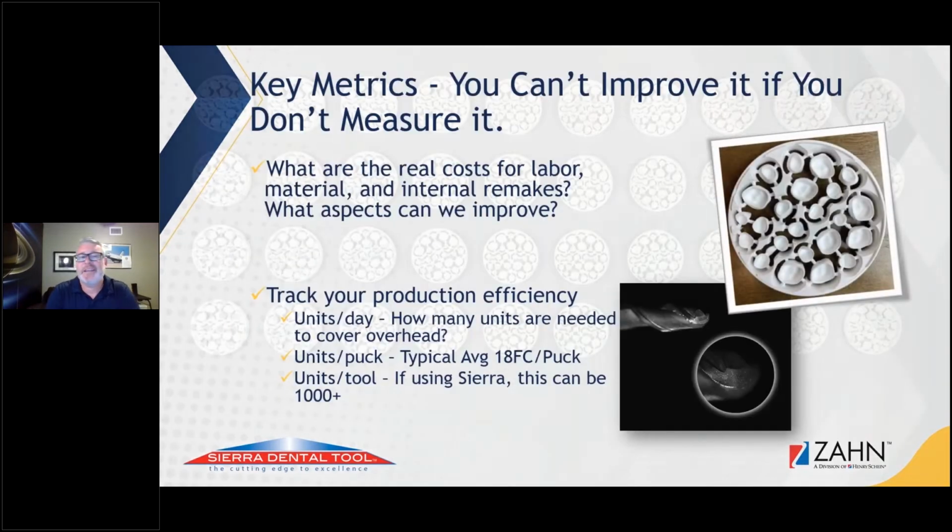So the key metrics that can improve that most people don't end up measuring, it's the labor. The labor cost it costs to actually do the case through the lab. You know, the design, we know that breakdown. We know what it costs to mill each unit. I'll teach you guys the cost of each tool itself, and then the labor to finish it out. Like if you have a remake, how much does that actually affect the lab?